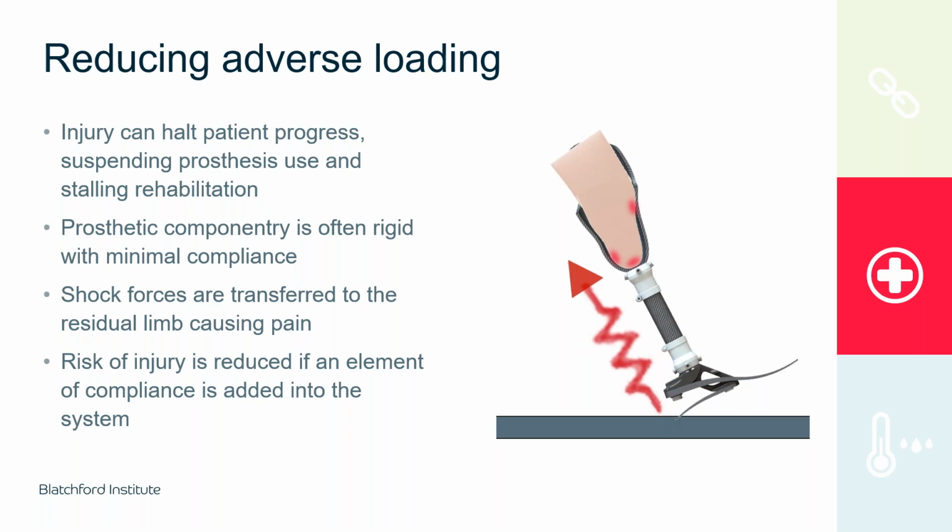Patients also tend to balance the loading of their limbs better as well. They're not in pain and trying to offload their prosthetic side, so are more comfortable putting weight through both legs. This further protects their joints in the long term.